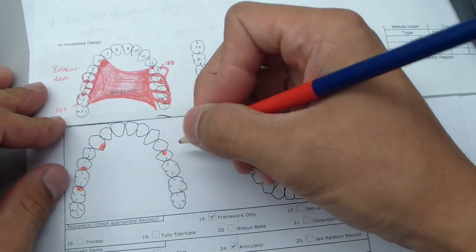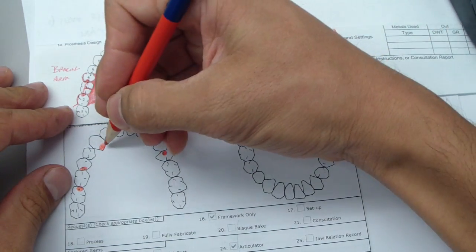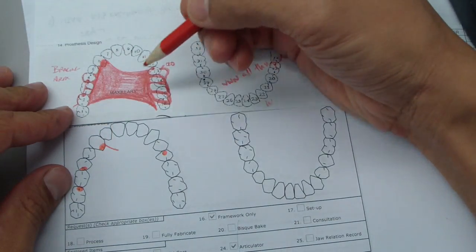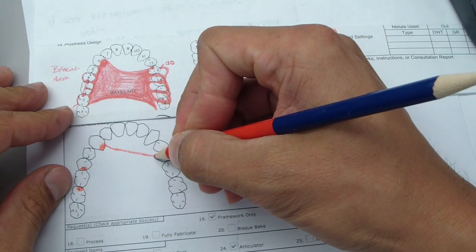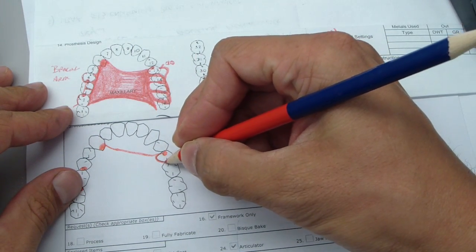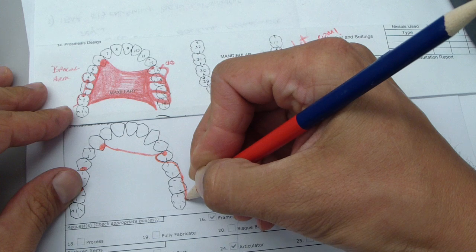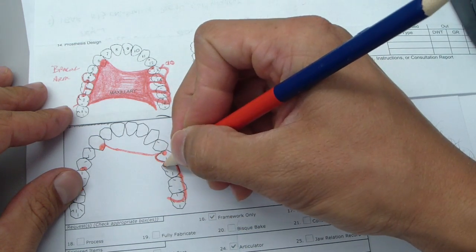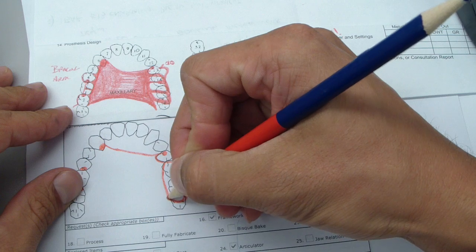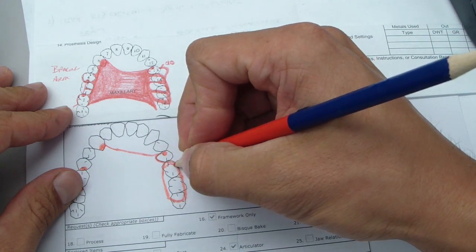Okay. And then we're going to bring this across from here, come around, then we're going to go over the edentulous ridge, come around like this, just going to join it. We're going to have some sort of linkage.